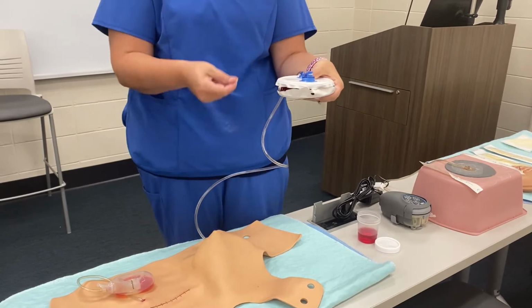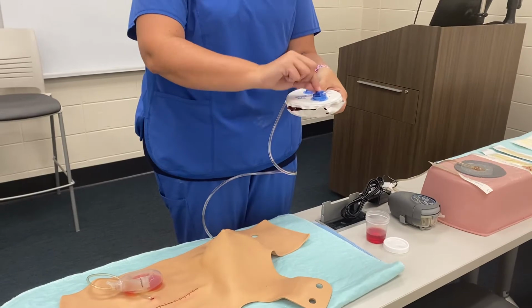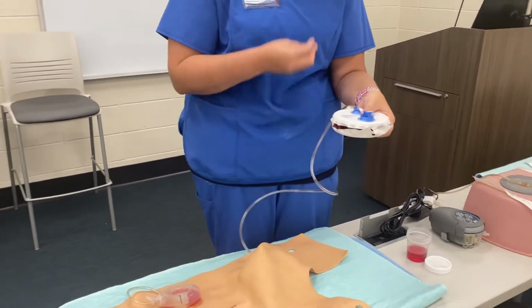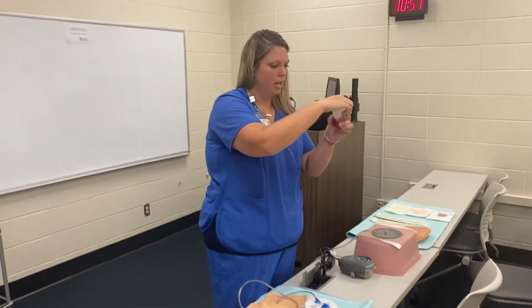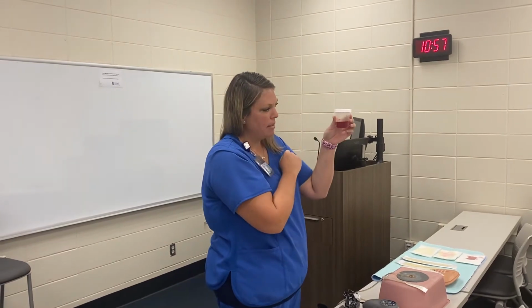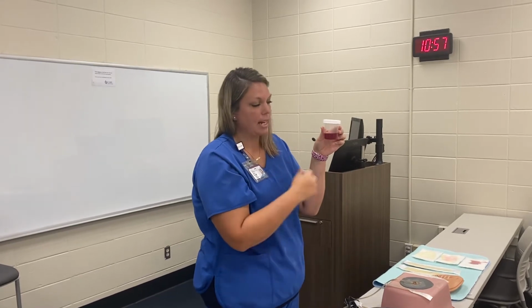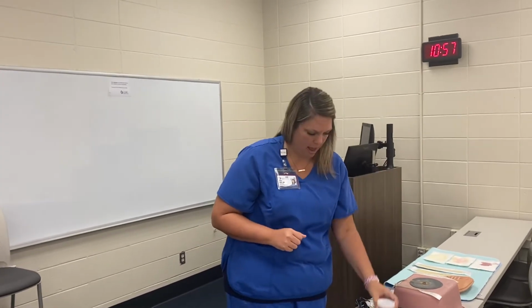Then you see it's closed, so that means it's actively pulling. Okay, if I go in and my container is open or it's not compressed, that means it is not working. It's not going to be pulling that suction. Okay, I would then measure and see how much output I had. And I have about 40 milliliters or 40 cc's. I would document that as output under that drain in Epic. Okay, I also have to document the color, the consistency, if it has any odor. I would need to make sure to document that too.